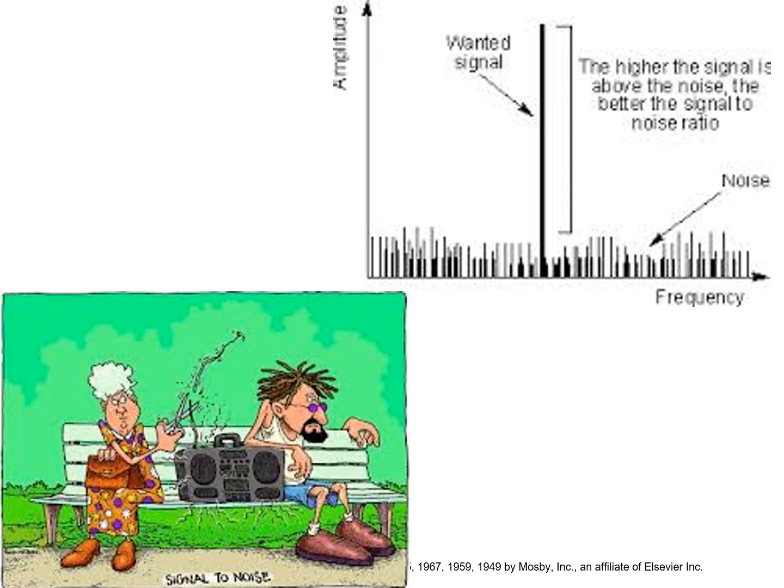That's what we want our image receptor to say about our X-ray beam. We want there to be weak amounts of noise in very, very tiny quantities, but the intended primary beam is 4 to 5 times stronger in amplitude than that random noise. And so it clearly can tell the difference. That's what we mean by a signal to noise ratio. You typically want the signal to be 5 to 6 times greater in amplitude than the noise.